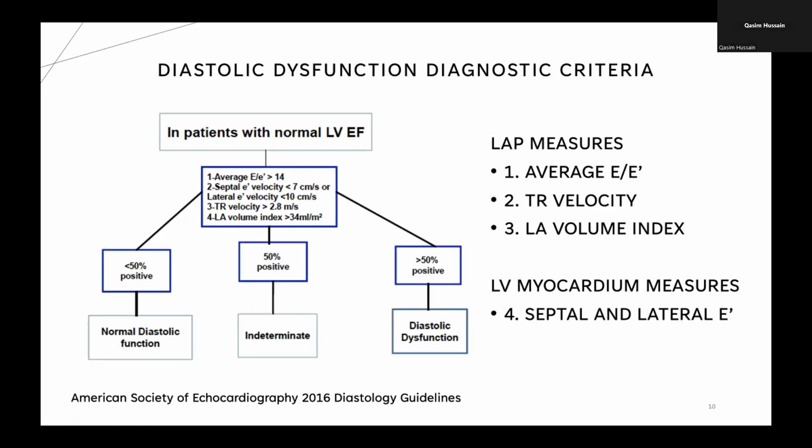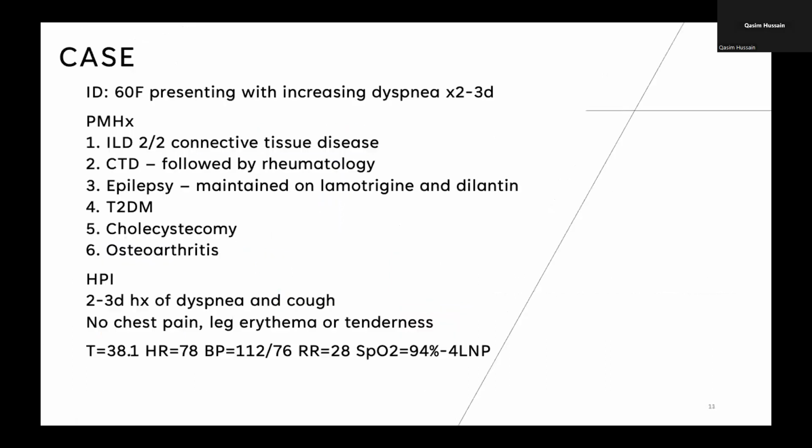And now this takes us to our case. Synthesizing all this together, there was a patient that came in recently, which this was perfect for. This was a 60-year-old lady that had increasing dyspnea for 2 to 3 days.